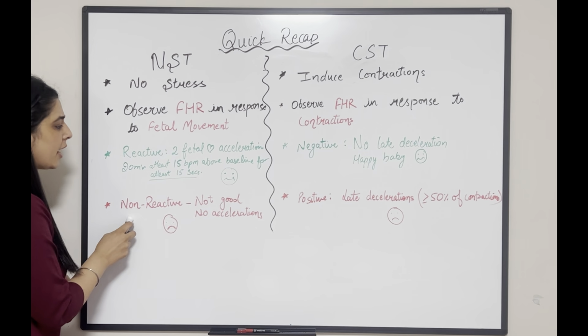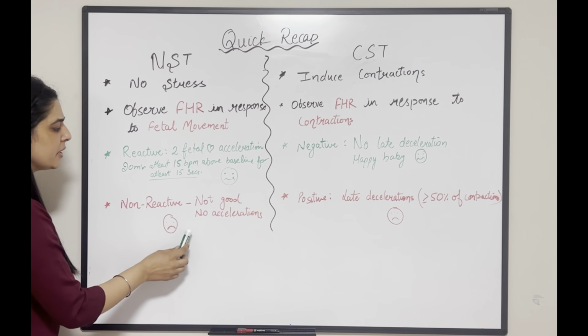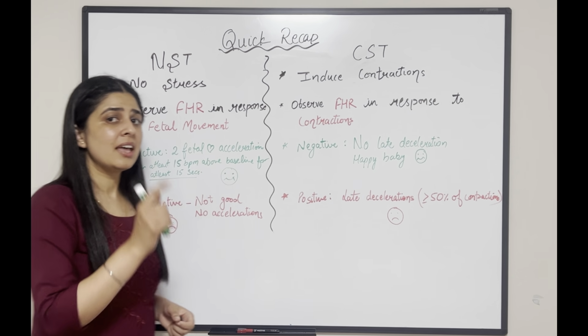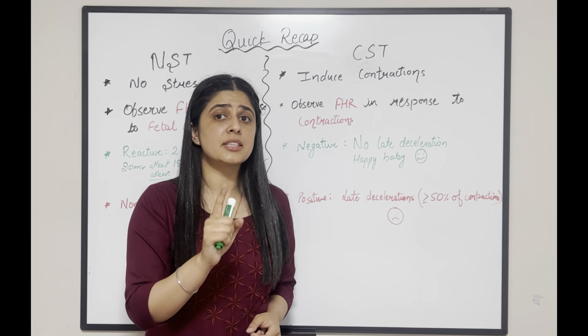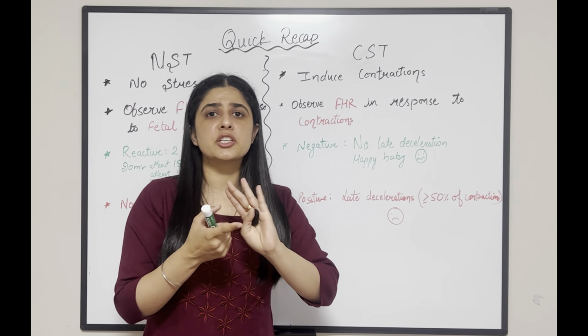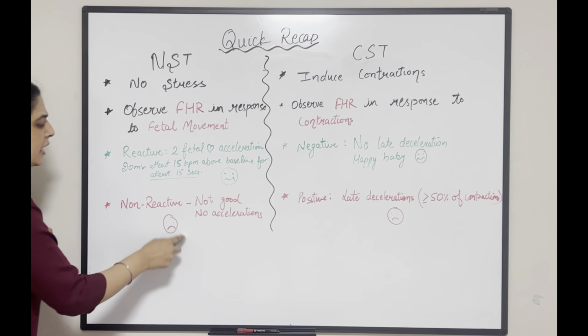That means your baby is getting an adequate amount of oxygen and has an intact nervous system. Non-reactive: a non-reactive non-stress test is not good because there are no accelerations. Whenever you have multiple N's, that is not good. Non-reactive, non-stress test, no acceleration is not good. Okay, so then we need further monitoring.